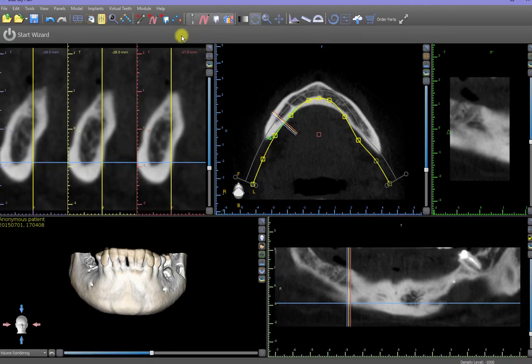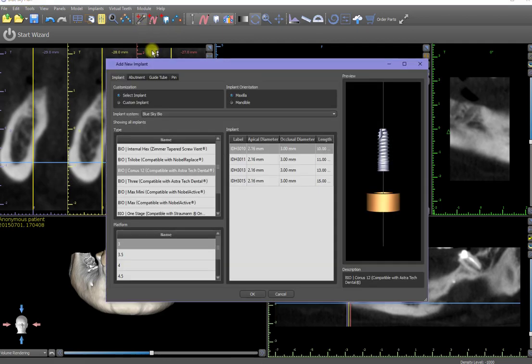You will now see the Add Implant icon along with all the other treatment planning icons on the toolbar, and you will now be able to place an implant.